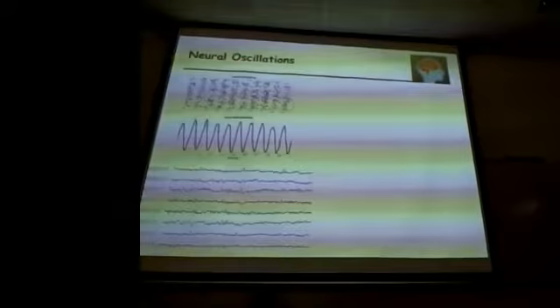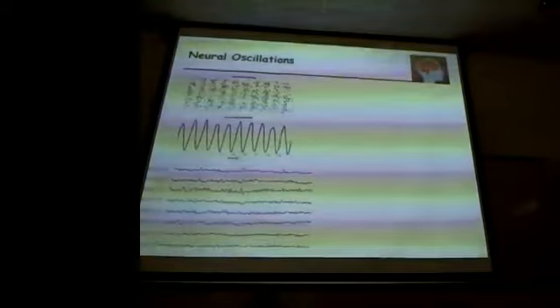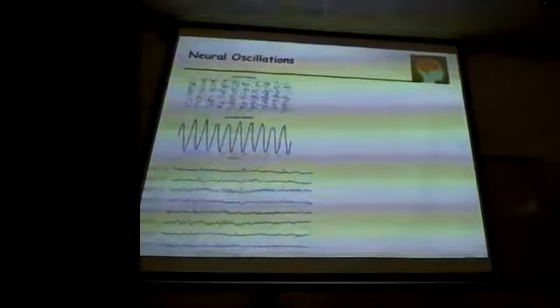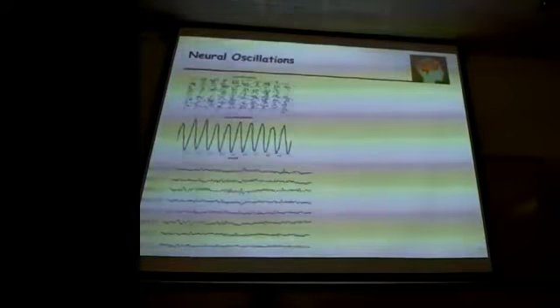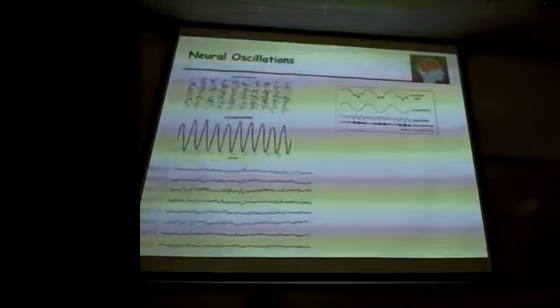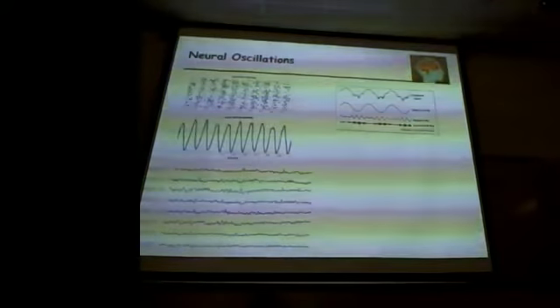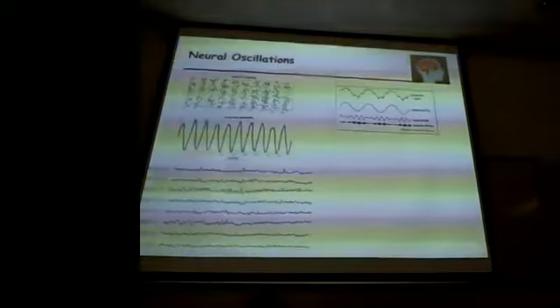So the other real difference between fMRI and MEG/EEG is that it's a more direct measure of brain activity. This is just an example of time courses. This is just a few channels. We have 306 channels that we're collecting data from simultaneously. But it's a time series. So obviously, you can do Fourier analyses of the combined signal, and you can look at the different frequency bands. EEG has been around for a long time, right? So we know that there are different frequency bands that are relevant to behavior, right?